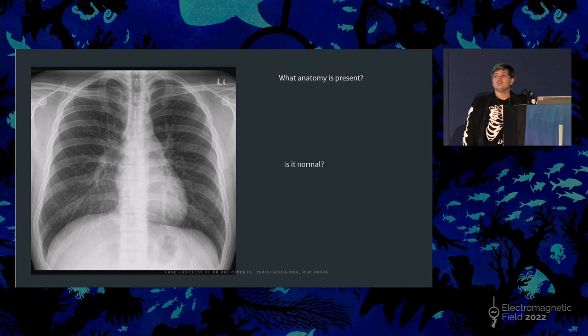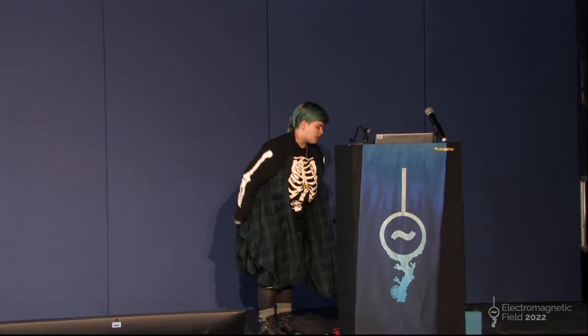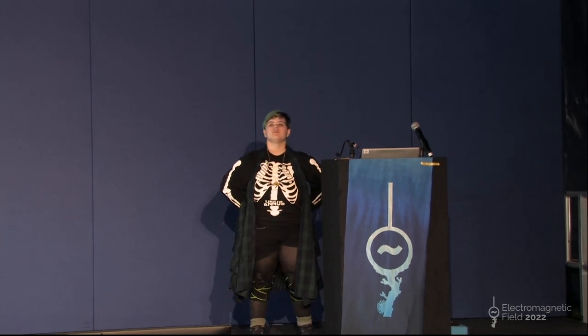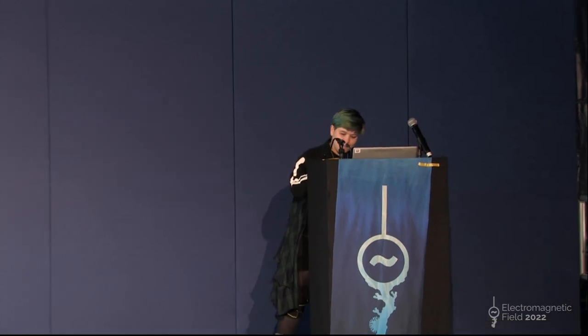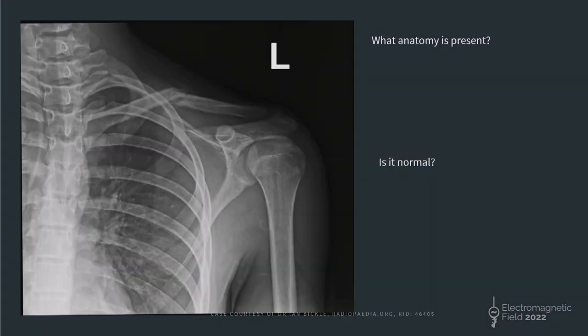You will find quite often the scapulae, those triangle bits to the side, have not cleared the chest. The way that you have to stand in order to clear the chest is like this. No one likes to do that. So when you have a patient and you say, can you bring your elbows forward? They all go like that. And you're not allowed to budge people anymore. So this is an excellent one. Right, I'd forgotten that I'd actually done another slide for this. Yes, it is normal. How about this?